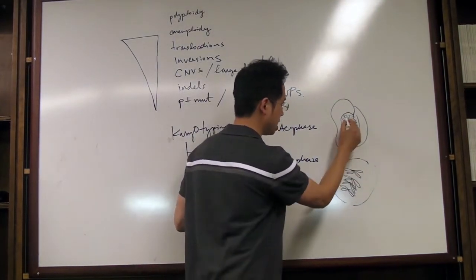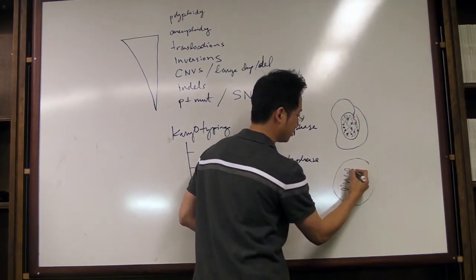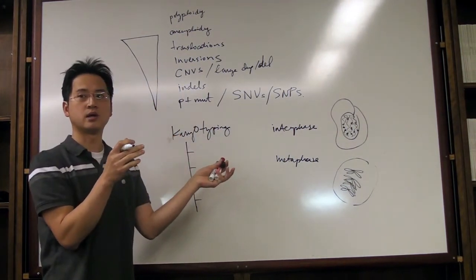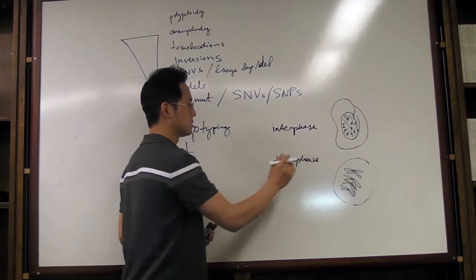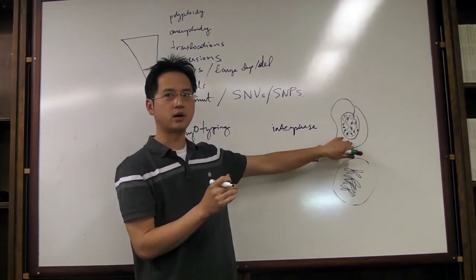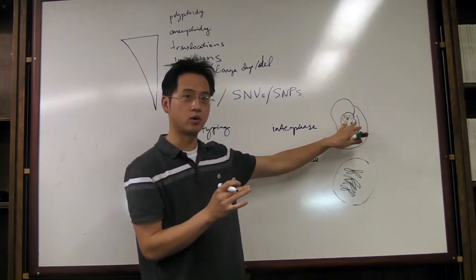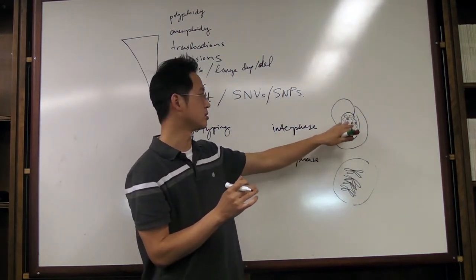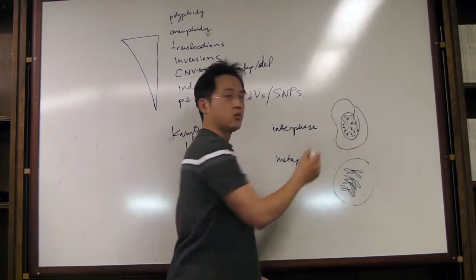So this is when the DNA, instead of being all unwound and loose, gets even more tightly wound and then condensed into a structure called your metaphase chromosomes. And that's when they're ready to divide into the daughter cells. This is important because if you were to take a microscope and try to visualize this by microscopy, you're probably going to be way out of luck to even see it, for one, without any staining, or maybe even with Giemsa staining, which is the traditional method of staining chromosomes. But you'd be hard-pressed to know what this region is versus what that region is versus what that region is.